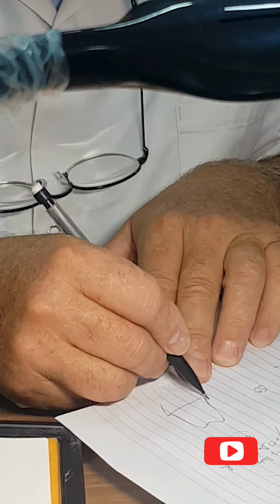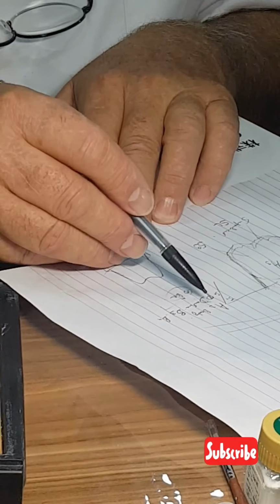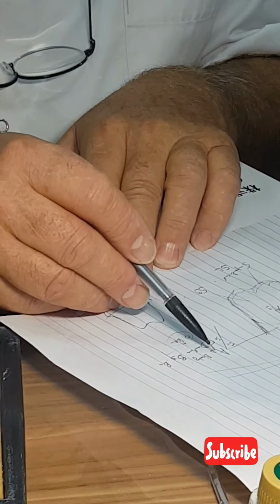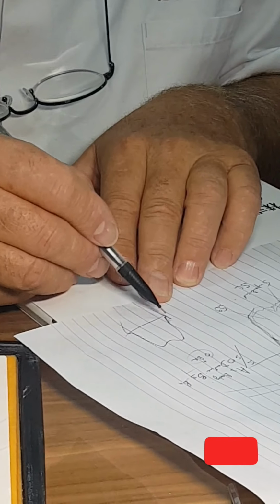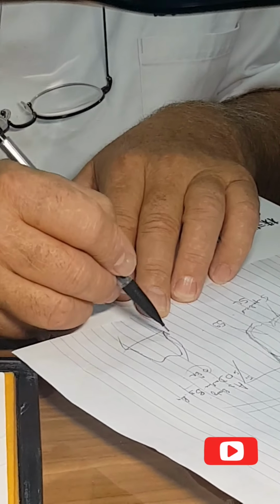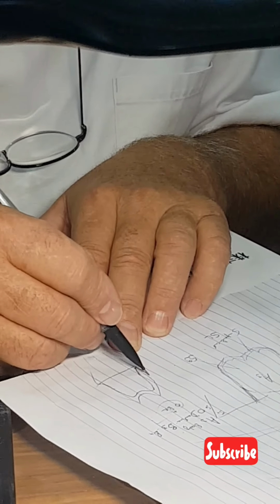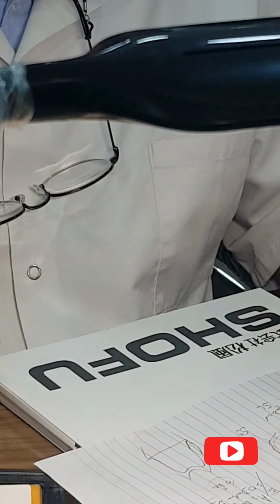That means if I want to give color here, it's why I do my mixture. Root, A3, opaque dentine, and orange. But here I finish: I build up my dentine, and I overbuild with that layer here to give thickness and deepness. It's an incredible product.